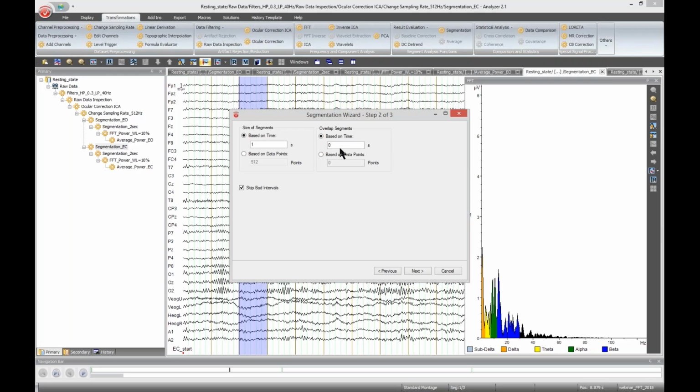Would you advise against performing FFT on segments recorded in an ERP experiment? That's also a good question. Like I have mentioned earlier, in FFT you would not gain any time information. In common ERP experiments, the time dynamics, or the dynamics of the frequency content, is sometimes desired.